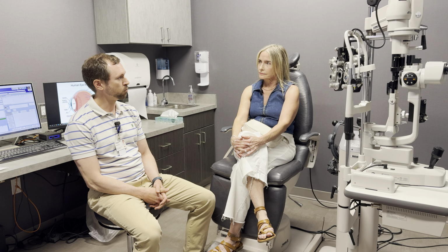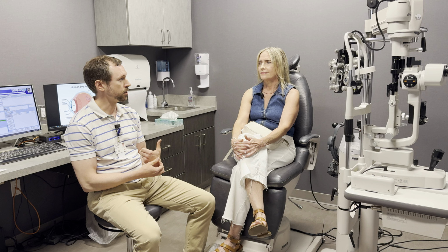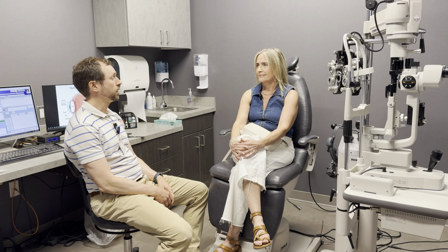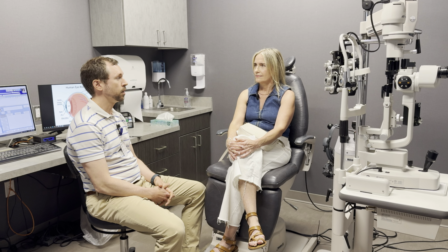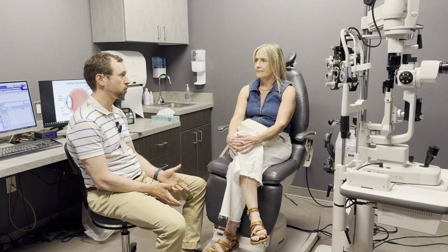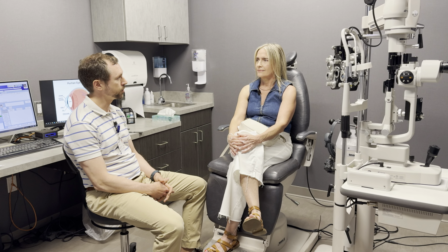But you might say, well, why in the world did we offer multifocal to this patient if we're sometimes a little bit conservative with multifocals in patients with a history of RK? Well, I think there are two important things to point out. For one, your RK was super regular. When we looked at your corneal maps, it was a very normal looking corneal map. You didn't have a lot of higher order aberration. It was 8 cuts per eye, but your corneal topography looked great.